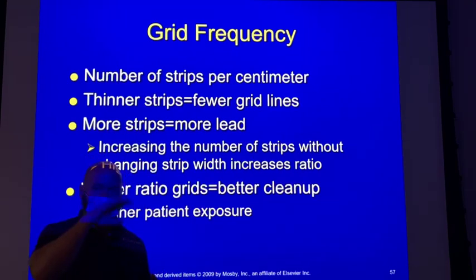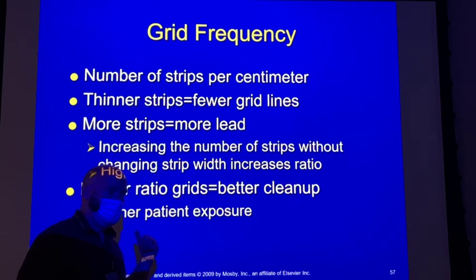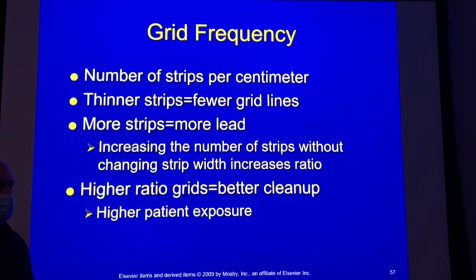So you've got a laser going back and forth really, really fast. And that raster pattern it was reading with was almost identical to our grid frequency in most of our even table buckys. So we wound up with a lacing artifact, or the moire artifact, on pretty much every image that we saw. So we had to get a dissimilarity. Where grid ratio and grid frequency come together is in solving that problem.